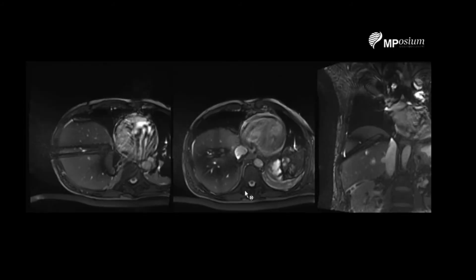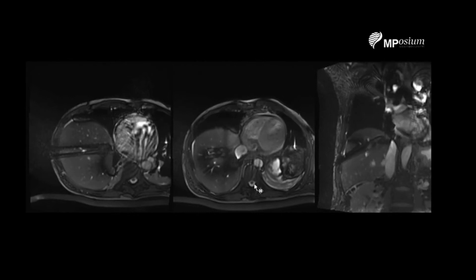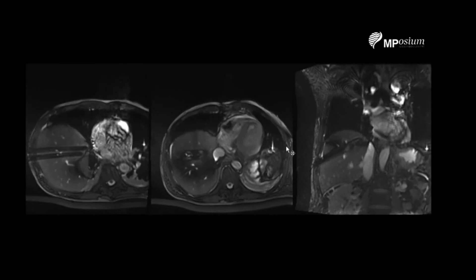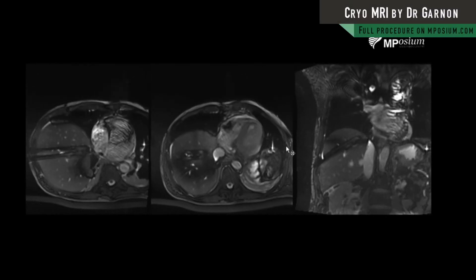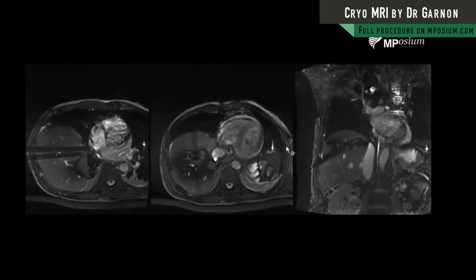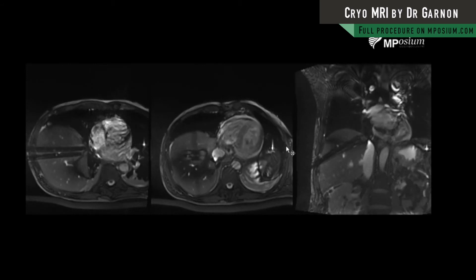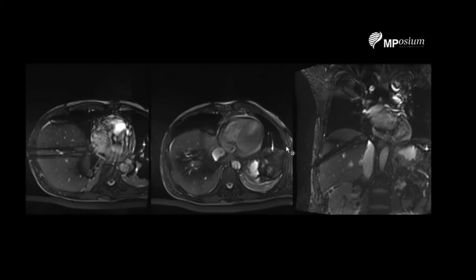This is mainly due to the artifacts around the needle on the real-time imaging, making it more difficult to appreciate the exact position of the tip with real-time imaging.